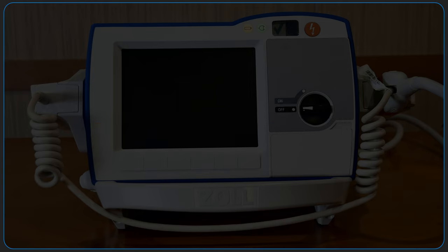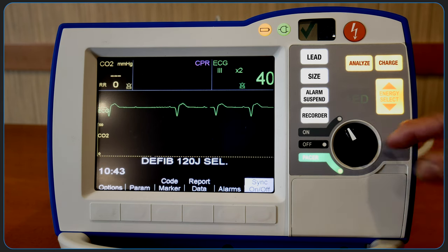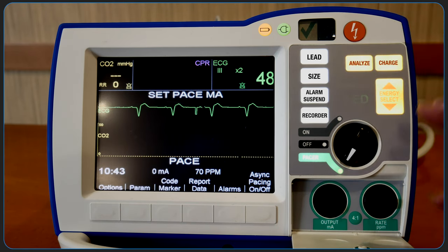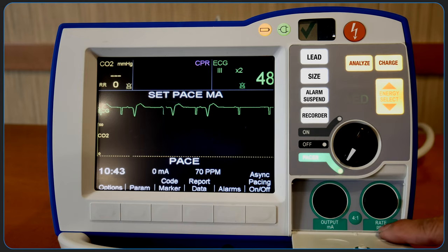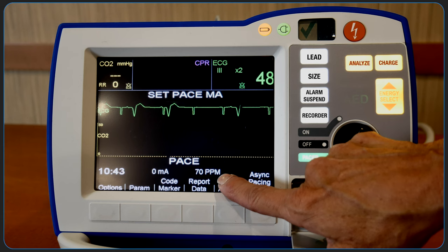Prior to pacing, first confirm that the 3-lead ECG electrodes are applied to the patient and that the ECG cable is connected. To pace, turn the selector switch to pacer and the pacer door will open. The first knob sets the pacer output, which is displayed as milliamps on the screen. The knob next to it sets the pacer rate, and here it defaults to 70.